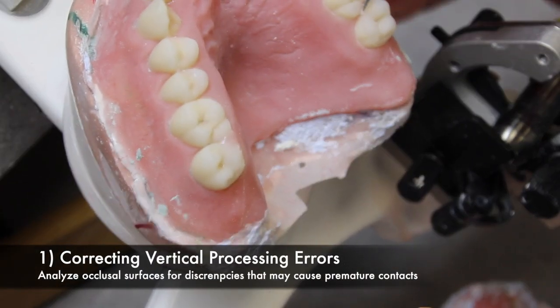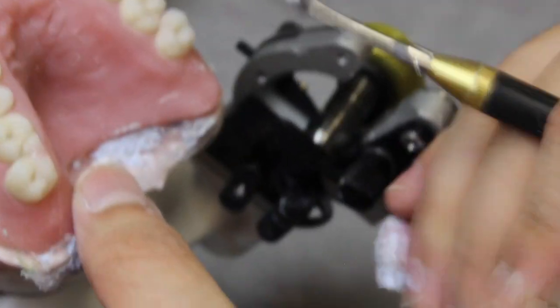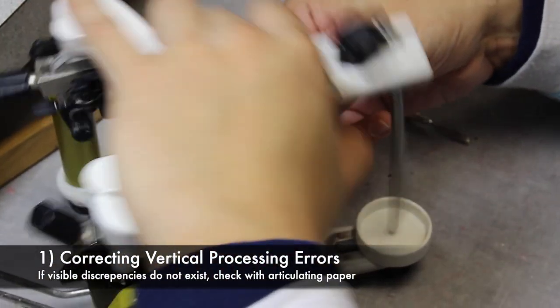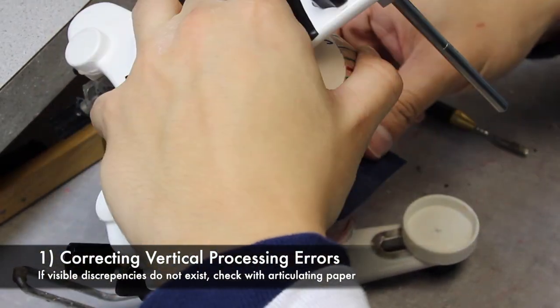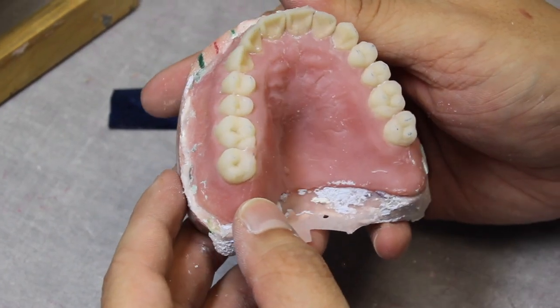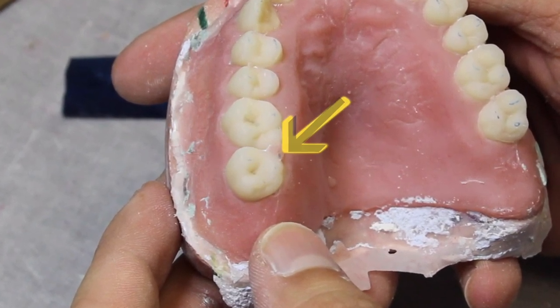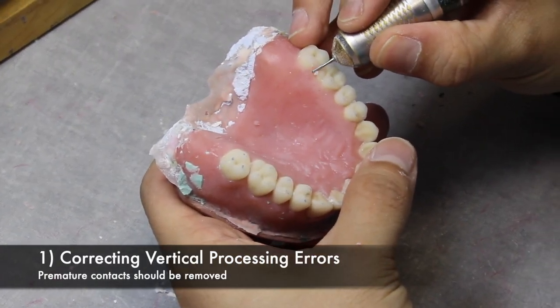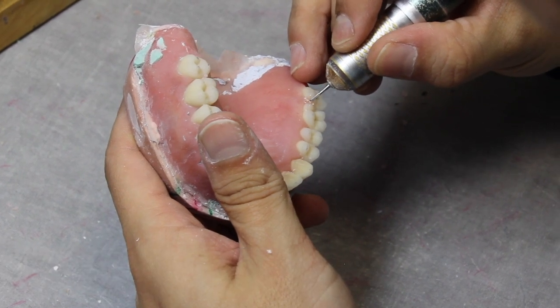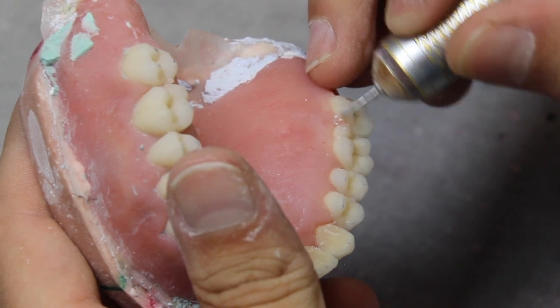Be sure to analyze the occlusal surfaces for discrepancies that may cause premature contacts, like acrylic flash that might have gone over occlusal surfaces. If you cannot visibly see any discrepancies, use articulating paper to double check. In this case, the premature contact is acrylic flash that has a contact point showing from the articulation paper. This point needs to be removed before moving forward. When removing flash from teeth, be sure not to damage the denture tooth itself, especially on occlusal surfaces.